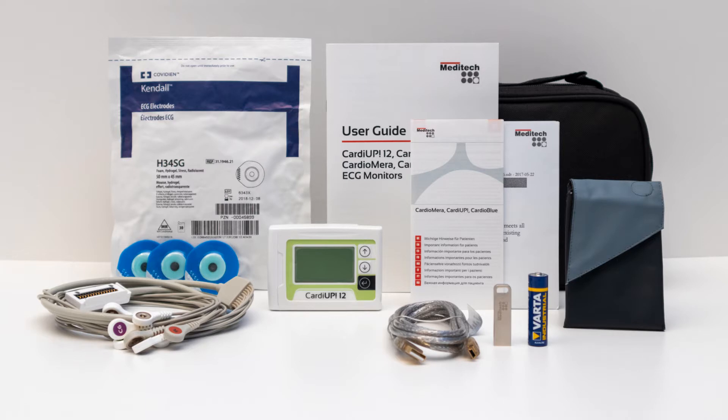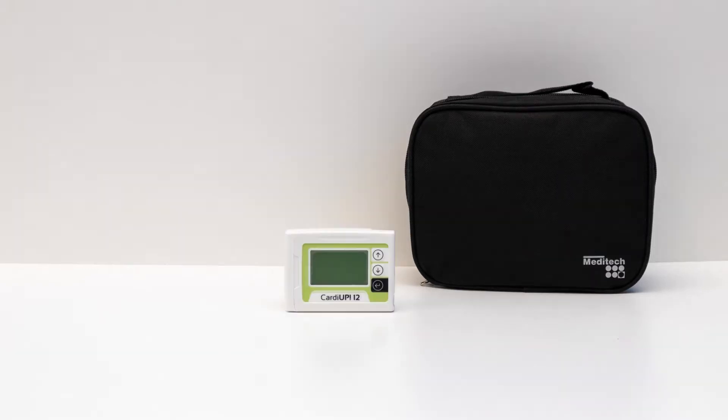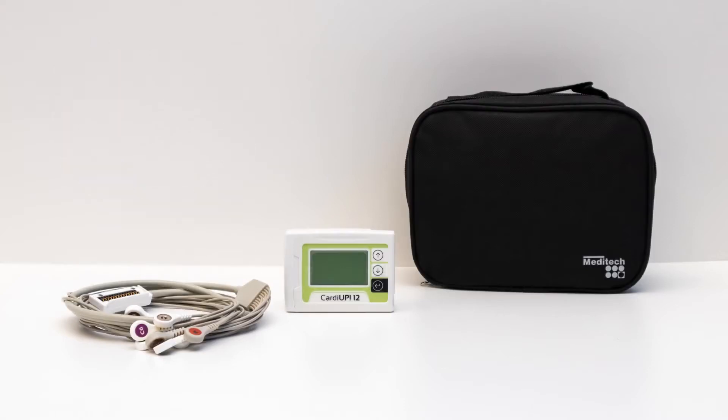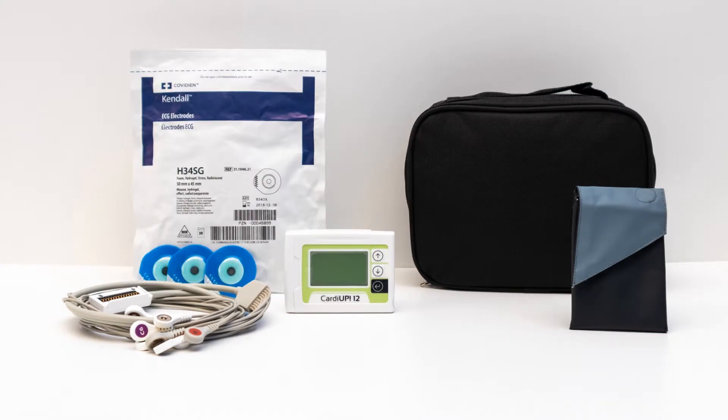Here comes the default kit content to start with. The black protecting case contains 1 recorder unit and 1 patient cable. The kit contains a 12-channel patient cable by default; however, an additional 3-channel patient cable can also be supplied upon request. Also included are 1 carrying case to apply the unit to the patient's body and 1 package of disposable ECG electrodes.